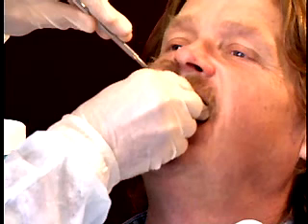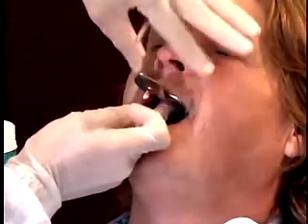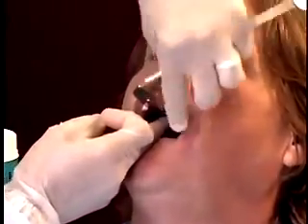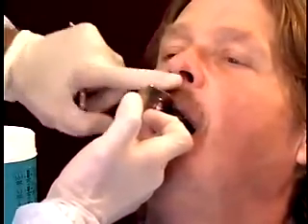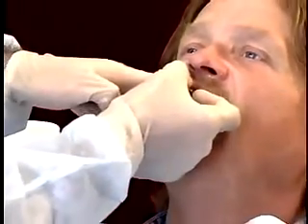Center the tray over the residual ridge so that the tray handle is in alignment with the median line of the face. At this time, elevate the upper lip so that the alginate flows into the labial sulcus. The seating pressure is stopped and border molding is performed so that the impression is not overextended. Hold the tray in place until the alginate has completely set.